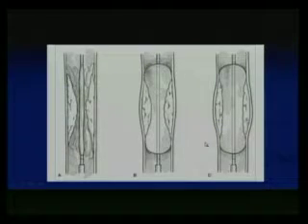So this is angioplasty that's demonstrated. So you cross the stenosis. So this is your balloon. You position it to straddle the stenosis. Then the balloon is inflated, and then you watch it on the angiographic image, the waist of the balloon. That's called the waist, like how big was the waist, and you watch it. And then the waist is visualized, and then you balloon, then it disrupts the intima, and then you take a post-angioplasty picture, make sure there's no flow limiting dissection, which you have to stent.